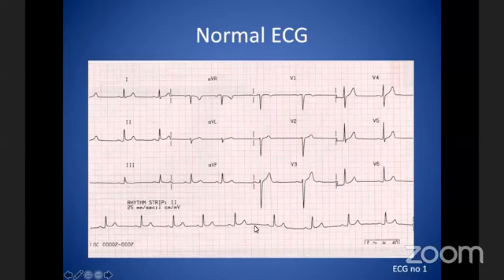So heart rate we've done, sinus we discovered, regular it is. Next, axis. Now, I am going to explain axis in a bit more detail, but here I can tell you very quickly, axis is normal. For the axis, you want to look at lead 1, lead 2 and aVF. And if all of them are positive, it's normal axis. That's just a simple thing for now, but in the next few slides I'm going to have a detailed discussion on how to look at axis, because a lot of people get confused about axis.